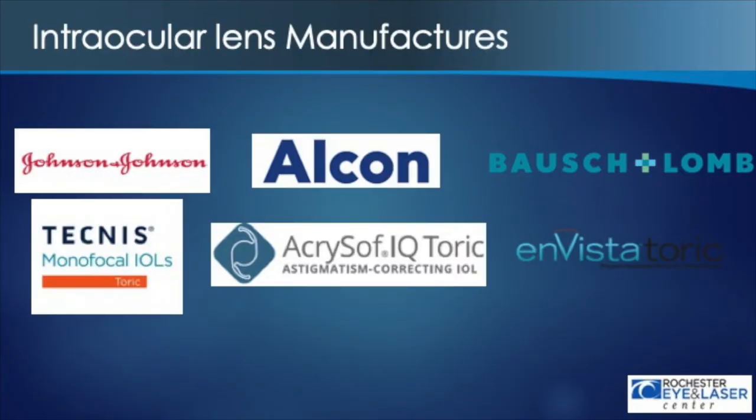Now, it's not to say that if you're in a dark restaurant with poor lighting and a little menu, you might not need some help. But our goal is to aim for being glasses free 80% of the time, okay? So that's what the multifocal lens is. These are just different companies that we use, Johnson & Johnson, Alcon, Bausch & Lomb, and different mixes of lenses. Dr. Lindahl goes into, yes?